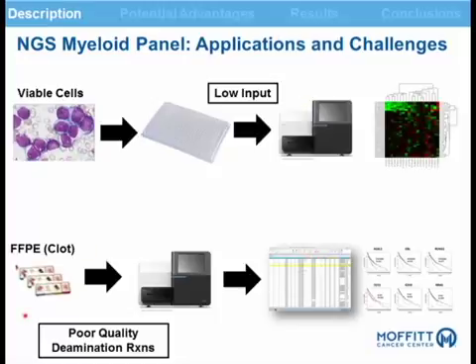And then the second thing we do is that in our disease, bone marrow biopsies are actually common. And because it is rare, we really want to leverage the tissue that has been collected prior. And in our institution, we're fortunate in that we have a total cancer care IRB-approved protocol whereby if patients consent, we can actually leverage this tissue to understand more about their disease. And so a lot of what we do is take this FFPE, perform the myeloid sequencing panel, and then associate it with clinical outcomes, survival, leukemia-free survival, phenotype differences.